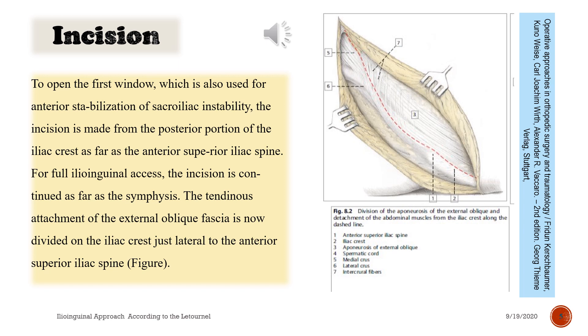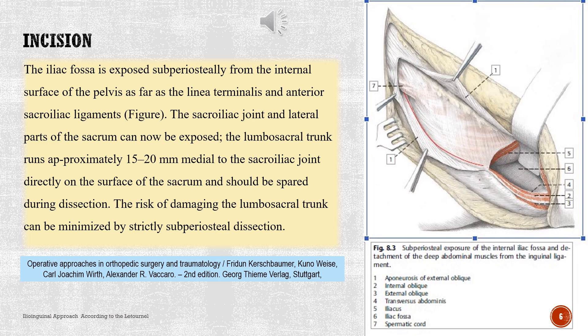To open the first window, which is also used for anterior stabilization of sacroiliac instability, the incision is made from the posterior portion of the iliac crest as far as the anterior superior iliac spine. For full ilioinguinal access, the incision is continued as far as the symphysis. The tendinous attachment of the external oblique fascia is divided on the iliac crest just lateral to the anterior superior iliac spine. The iliac fossa is exposed subperiosteally from the internal surface of the pelvis as far as the linea terminalis and anterior sacroiliac ligaments. The sacroiliac joint and lateral parts of the sacrum can now be exposed. The lumbosacral trunk runs approximately 15–20 mm medial to the sacroiliac joint directly on the surface of the sacrum and should be spared during dissection. The risk of damaging the lumbosacral trunk can be minimized by strictly subperiosteal dissection.